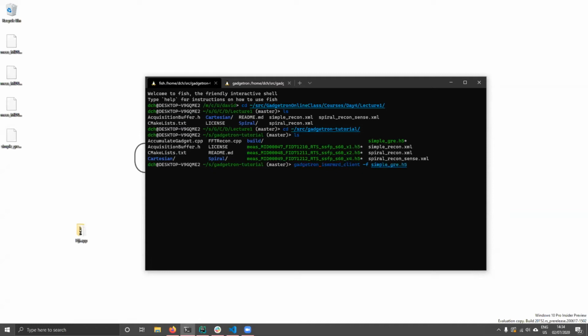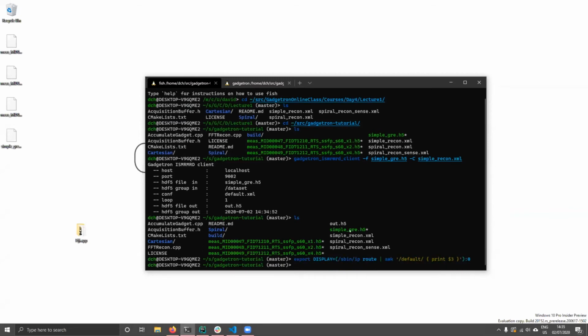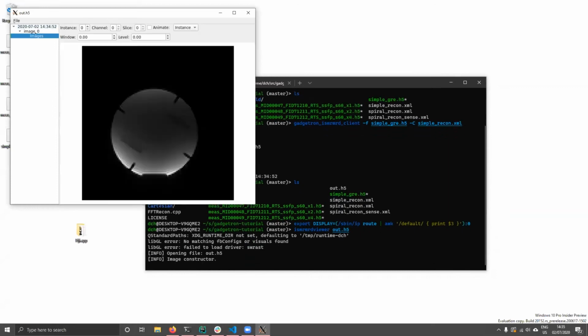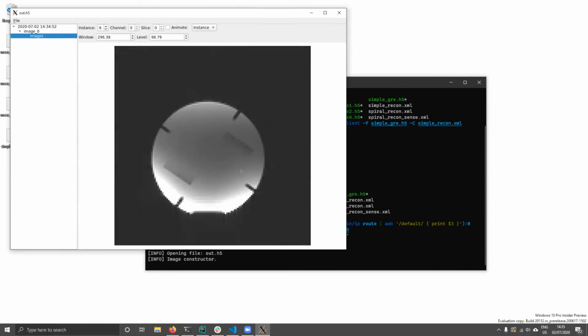Gonna use the simple GRE dataset and our file here. Okay, ran. We have some output. I need to do some magic for ISMRMRD view to work. And we have images. Hooray. And you can see it's reconstructed all 10 of them. So this is the same data set that Christopher was showing a week ago.